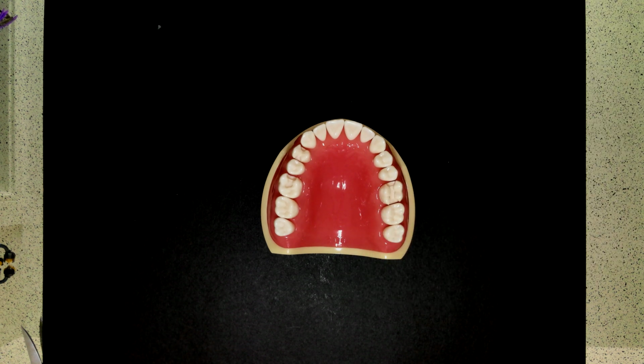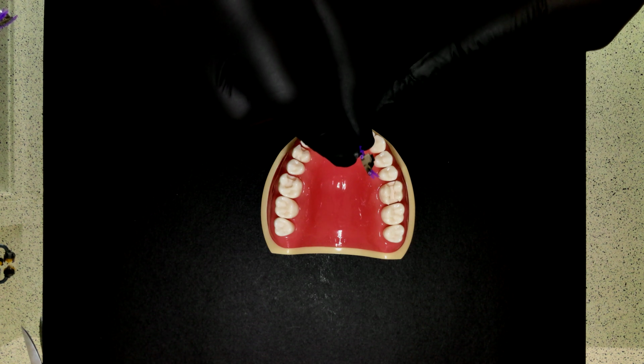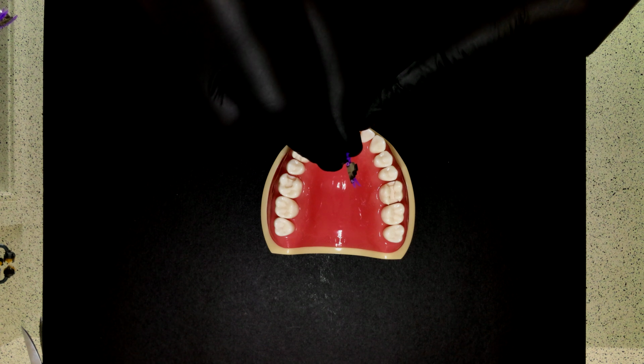We'll demonstrate a few different situations here with it. Just to show you the basic layout of this system, we will demonstrate it on the mesial of that isolated molar. So this is the Burton Band's posterior matrix, and you can see that it is a very unique system.